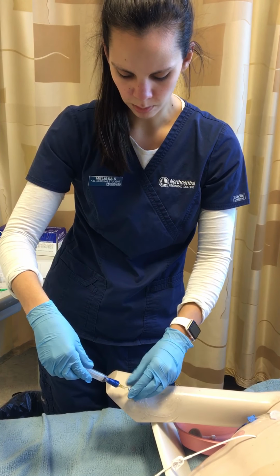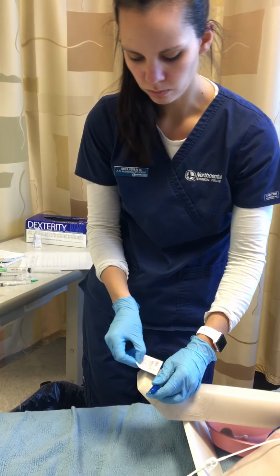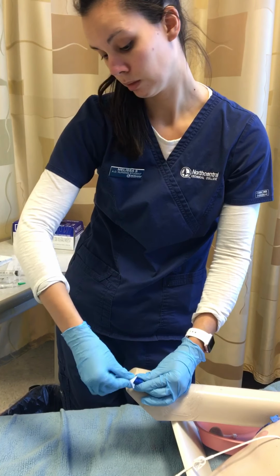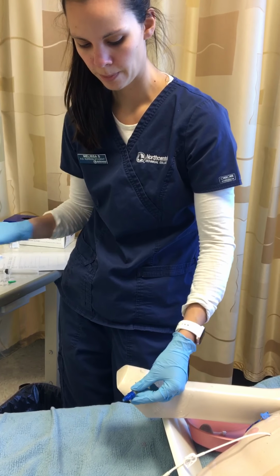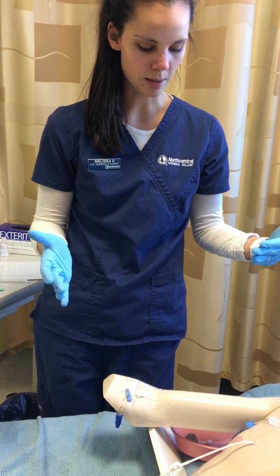Okay, and then I'll clamp. And then I'll clean the site again. And I'll put a cap on if my facility requires. When I'm giving the med, I'll make sure to assess for any adverse reactions that the patient may have.